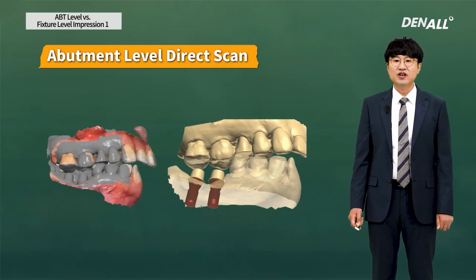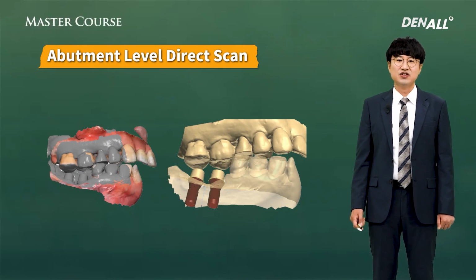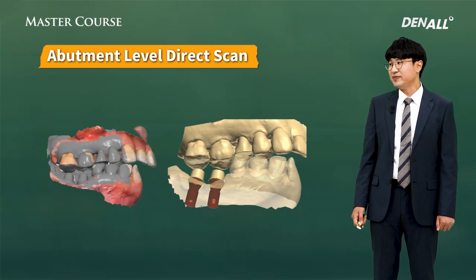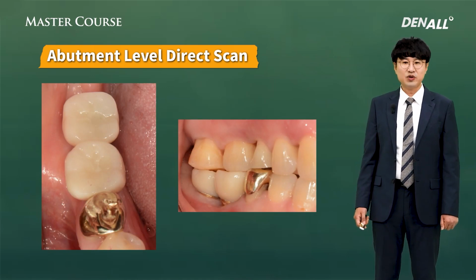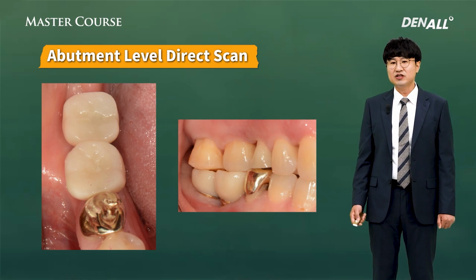On the anterior side with this occlusion, if there was a gypsum model, it would have been difficult to mount, but with scanning, you can obtain the model easily. So the final prosthesis was made, and only occlusal adjustment was needed, with minimum effort. So you can also do this with the custom abutment.